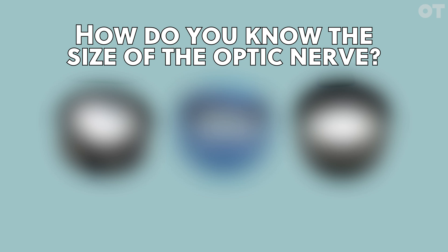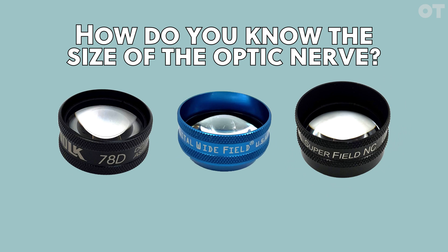How do you know the size of the optic nerve? You can get an approximate measurement of the disc and cup using a slit lamp biomicroscope and a high-powered condensing lens, commonly known as a volk lens.